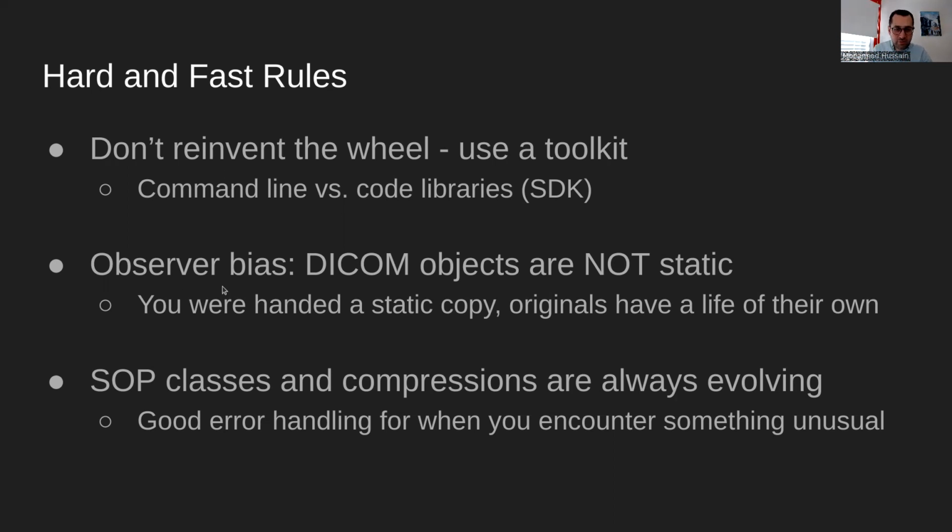Be careful of observer bias. A lot of people come into this domain, get dumped a bunch of DICOM .dcm files, and assume that's what DICOM is all about. But DICOM objects, studies, and series are not static objects. They actually have a life of their own. Studies can be merged, studies can be split, images can be removed for quality reasons, etc. Patient demographics are sometimes updated.